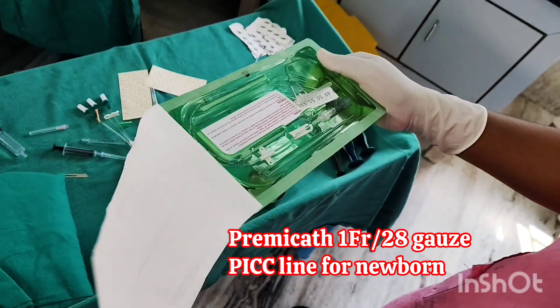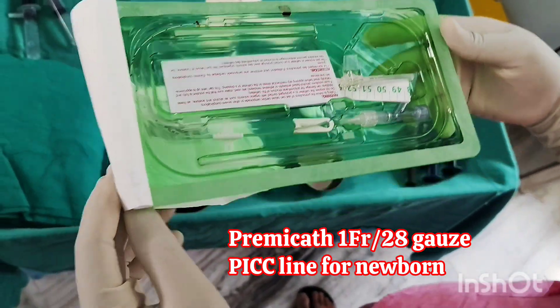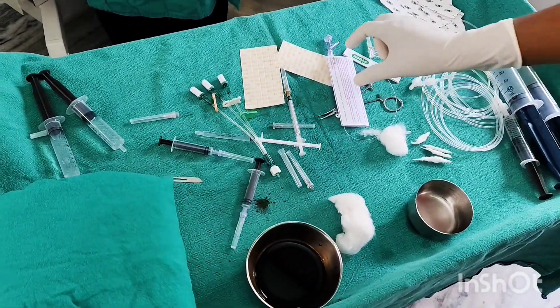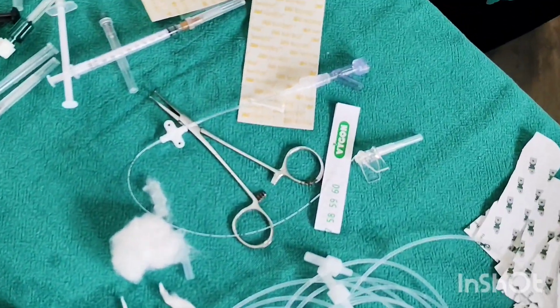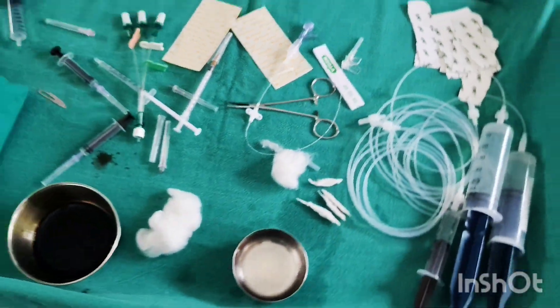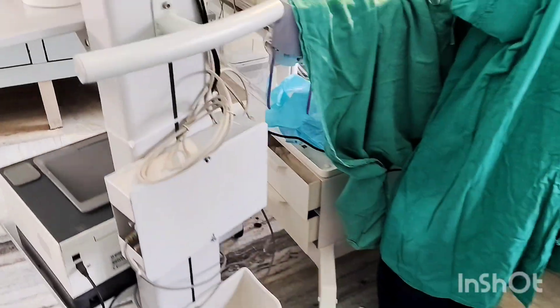This is a 1 French PICC line used for newborns, with a cost of around 9,000 rupees. It is a polyurethane catheter, 20 centimeters long with a single lumen, graduations every centimeter, fixation wings, and an integral extension tube with a clamp.